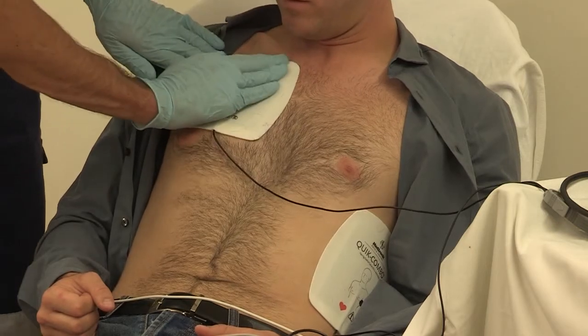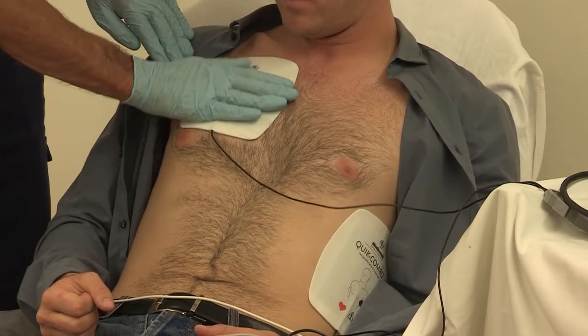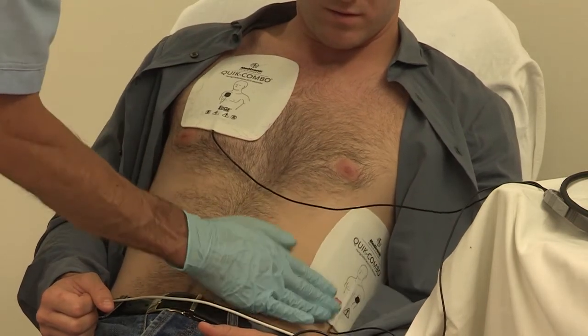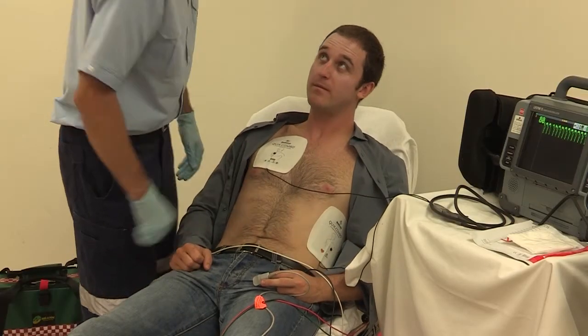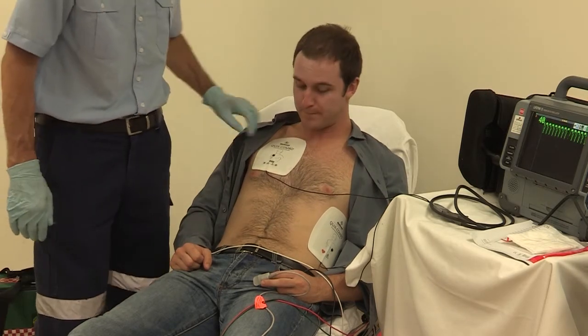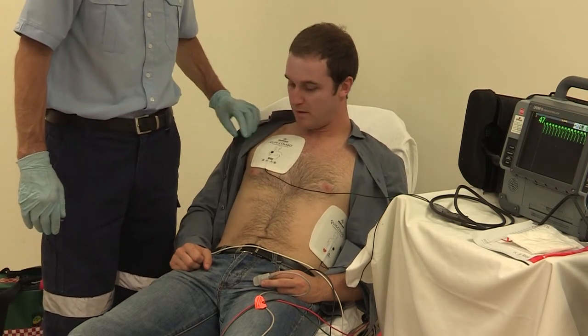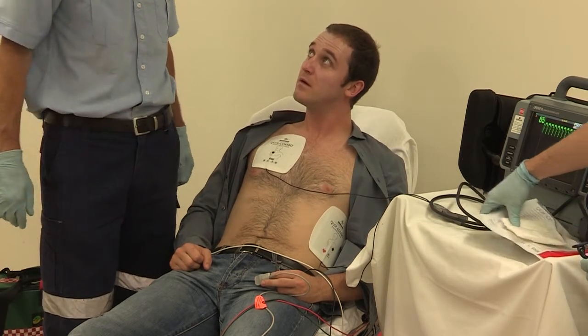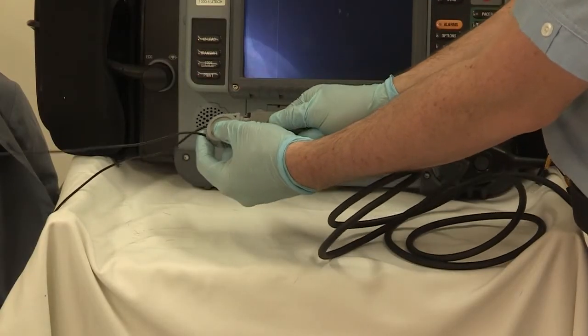The critical process here is making sure the pads are adhered to the skin correctly. Be careful to handle the patient correctly, and at all times explain to them what is happening. Remember that this may be a frightening time for them, and clear communication with the patient is paramount. Connect the cables to the machine.